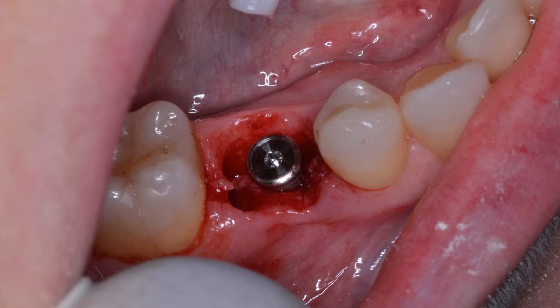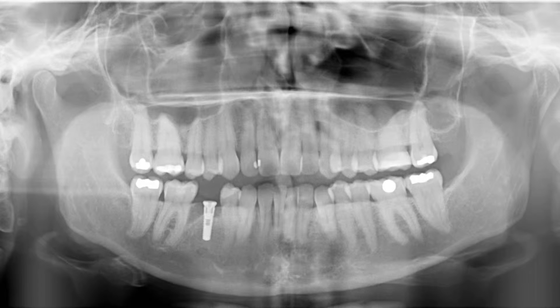We will now demonstrate placement of the bone graft in those gap junctions and placement of a collagen membrane — in this case a collagen plug — and suturing that in place. This panoramic radiograph demonstrates the implant in place. You can see we are well away from the mental foramen, with the cover screw visible and bone levels looking lovely. This was the post-operative treatment radiograph.